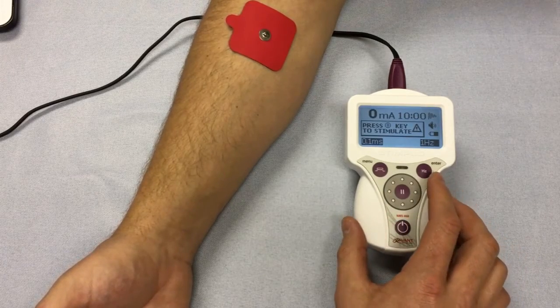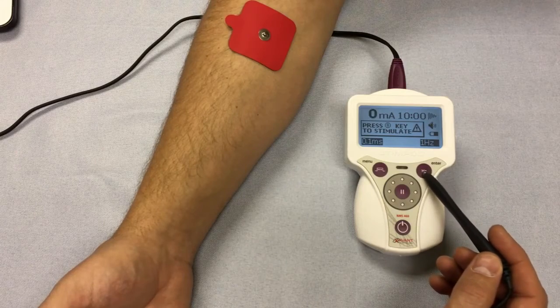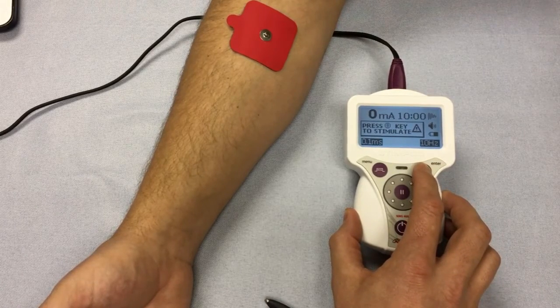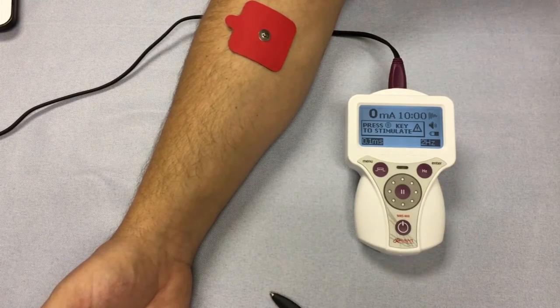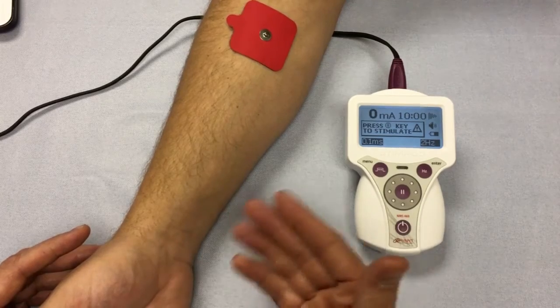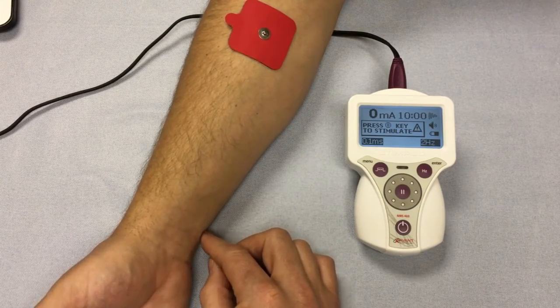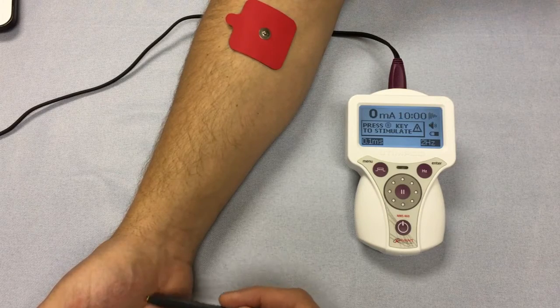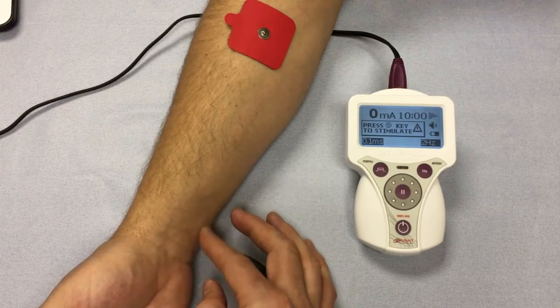The second button is the frequency button. The frequency is displayed on screen with its corresponding button showing the hertz symbol. There are a few options: 1 Hz, 2 Hz, 5 Hz, and 10 Hz. We recommend 2 Hz for most applications. The next step is to apply gel to the target area. For this demonstration we are going to find and stimulate the ulnar nerve. The associated muscle to the ulnar nerve is the adductor pollicis, so we'll look for a fasciculation of that area. I'll apply a little conductive gel to the general area.